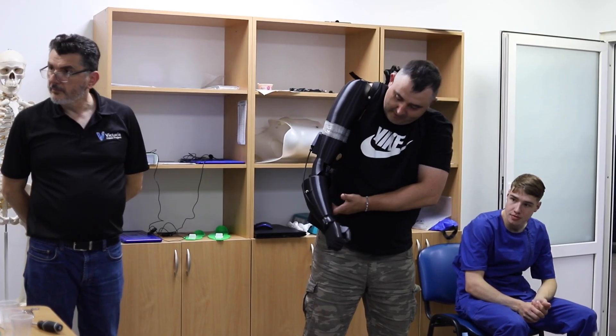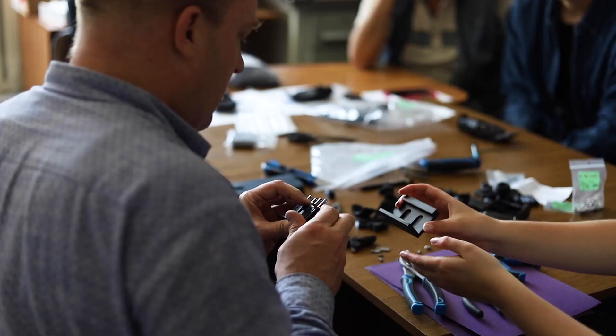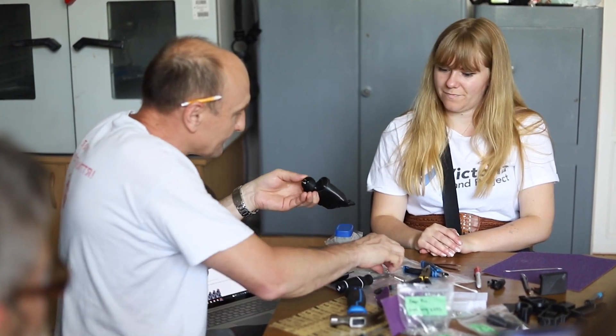Using the Ultimaker printers with the Formlabs AM material, we're able to produce these prosthetic devices. The quality is amazing and the strength is also very important for the prosthetic devices. Many clinicians around the world are very happy with the end result.